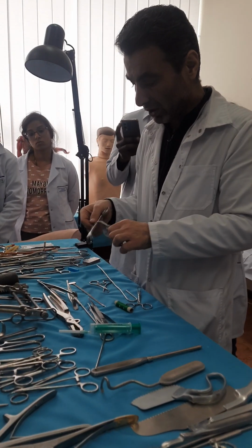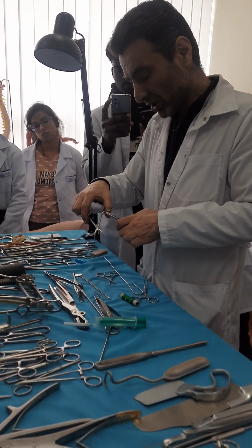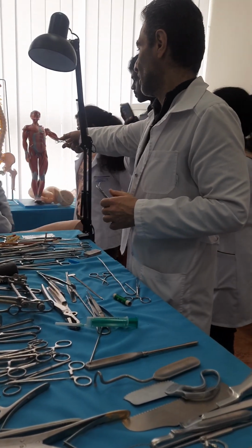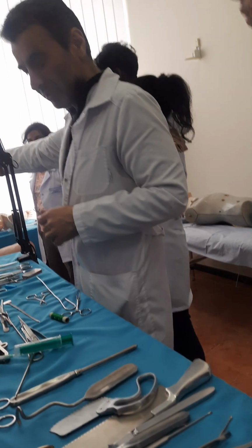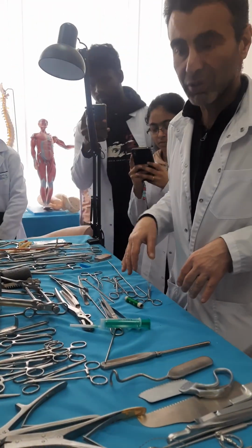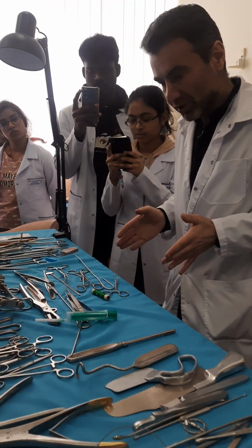Huge amount of towel clips. So you clip the towels. Usually, for example, on that table, you can see the paper towels. We use them for separation of the surgical field. Usually you put two longitudinally, two horizontally.